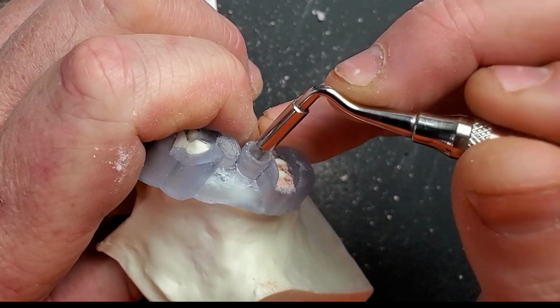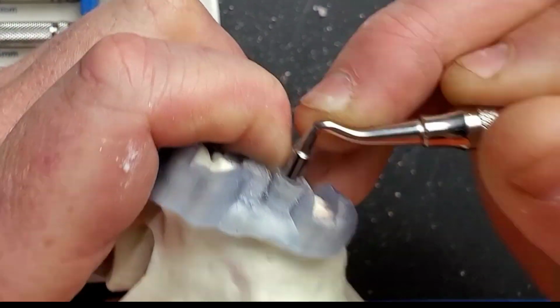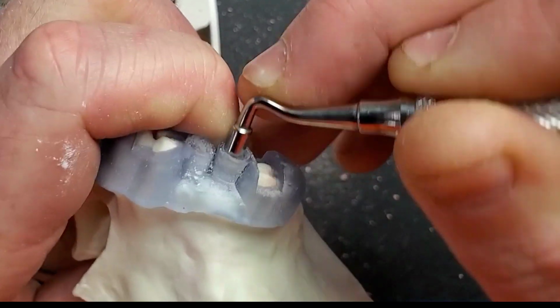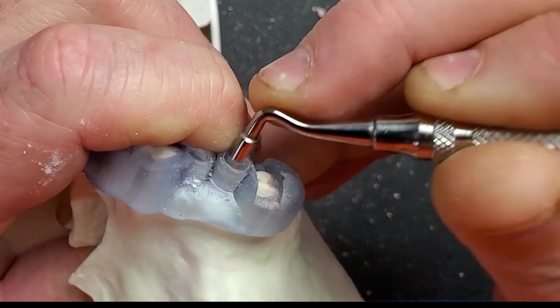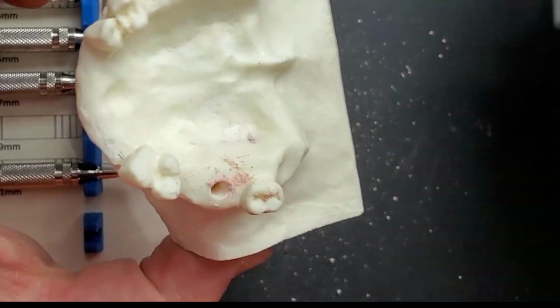So with a little bit of bone in the osteotomy site, I'm going to just go ahead and start poking at it. And as I do this, I use a lateral kind of wobbling motion. What that does is that gets that bone to condense laterally and doesn't just put all apical pressure on this, okay? Now for the remaining loads, I'm going to go ahead and remove the guide so that you can see a little bit easier.